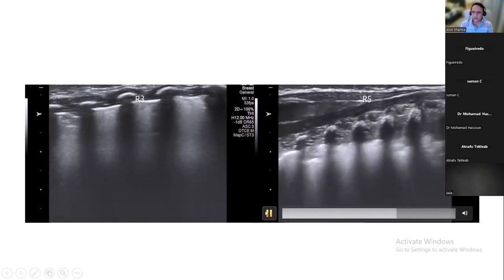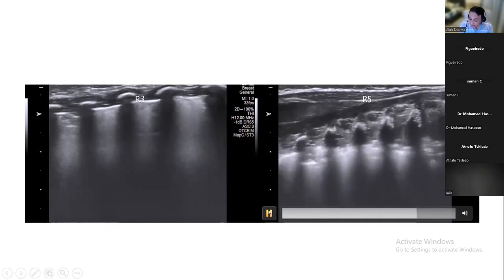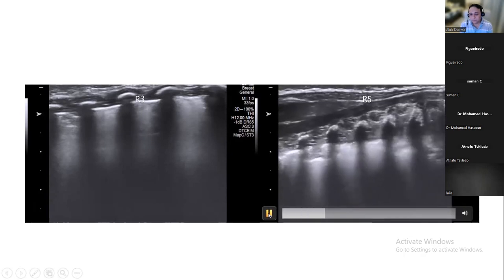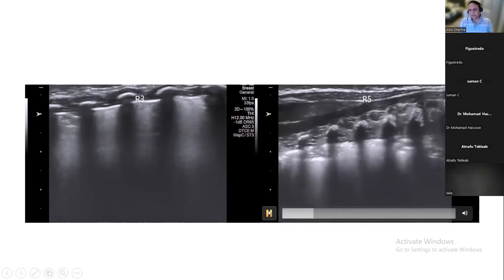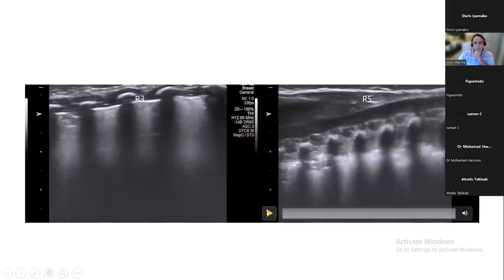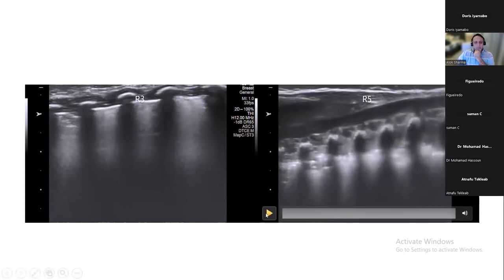At what age was this, Dr. Etnafu? Sir, 36 hours. And the CRP had not gone up. Actually, CRP was done at the age of 12 hours post-delivery. It was not elevated at that time. Okay. Would be interesting to see what the CRP is at this point. And how has the baby behaved since then? In distress, still requiring high ventilator setting and SIMV mode, FiO2 of 60 and rate of 30, I think, if I'm not mistaken, but still a little bit on the higher range of ventilator setting.